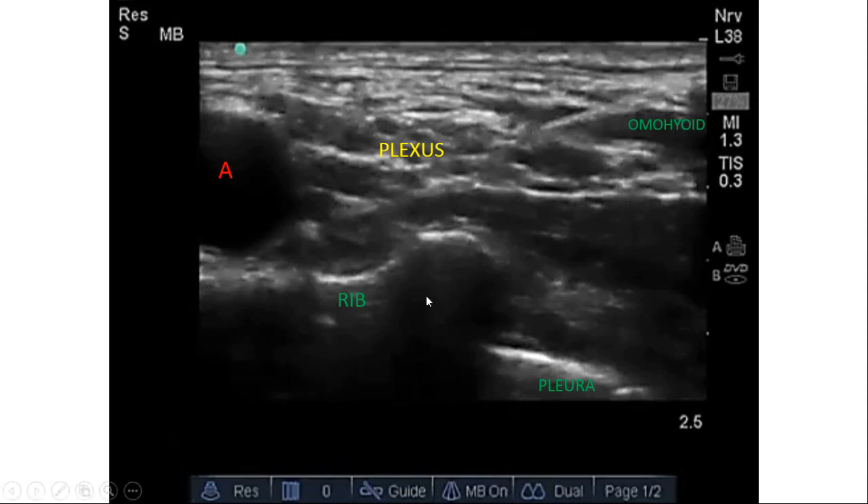Now let's see the sono-anatomy. When we put the probe, the first important landmark is the pulsatile subclavian artery resting on the first rib, which looks hypoechoic. Posteriorly it creates an acoustic shadow. The artery is anechoic, the rib is hyperechoic, and just below that is the pleura which is hyperechoic and shows a lung sliding sign.